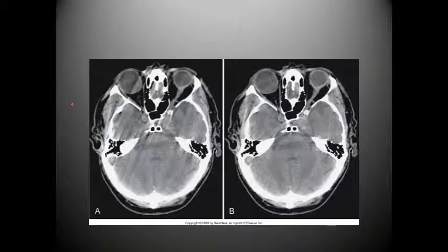So here we see patient motion, image B and image A. Image A has tons of patient motion, and as you can see, you have these lines that are running through the patient's head. It's most prominent here in the eye, and image B does not contain this. It looks more of a uniform image, and that is simply because the patient is not moving.